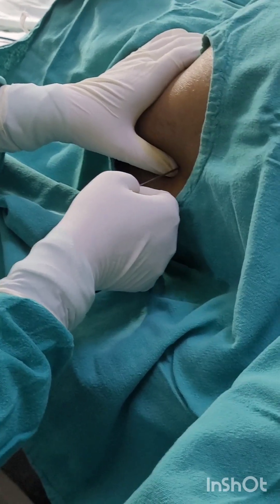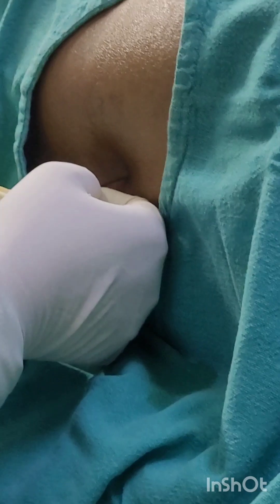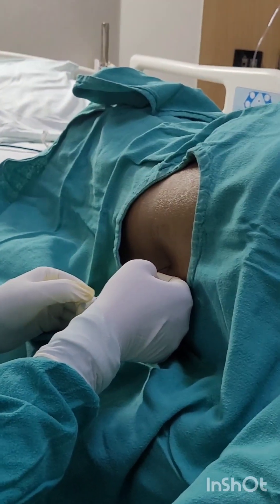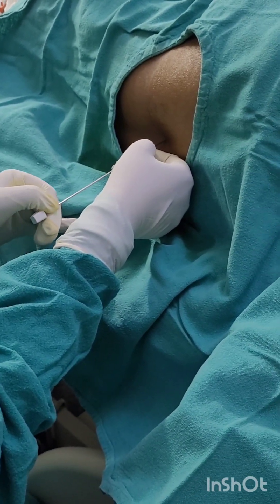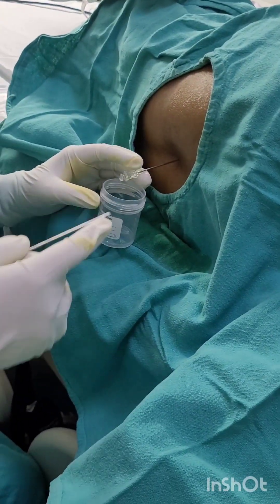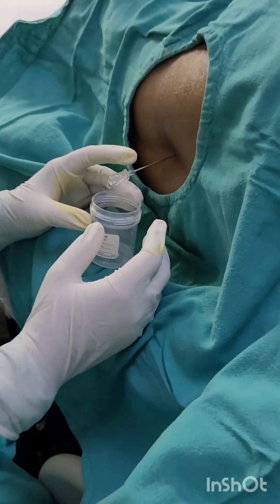I am inserting the stylet-containing lumbar needle and I felt a give away, so I am at the right place now. I can attach the manometry to it, or I can collect CSF in five different bottles. At the same time I have to check the RBS as well.